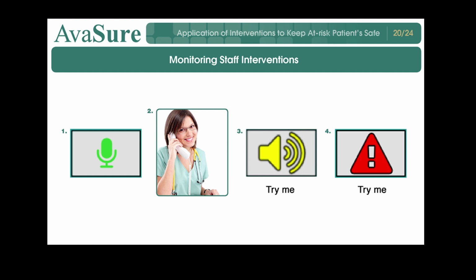4. Monitoring staff are encouraged to use the Stat Alert alarm whenever they believe the patient is at risk for an adverse event. Whenever you hear this alarm, please respond immediately to the patient's room, whether or not that patient has been assigned to your care.